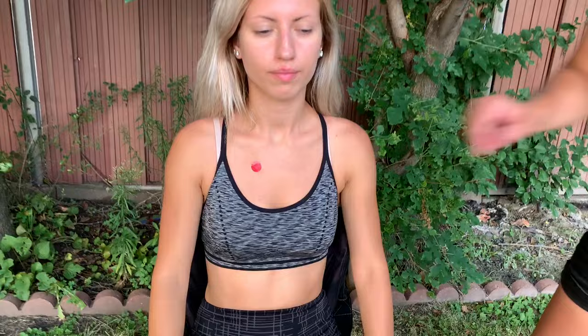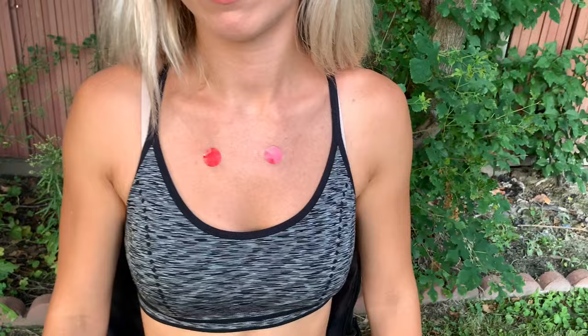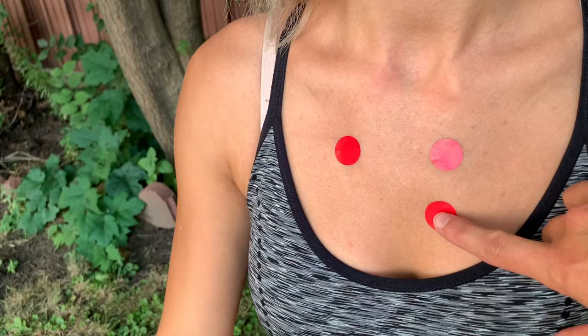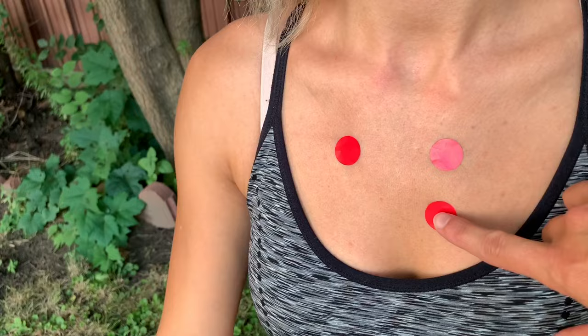The first point, second intercostal space, right sternal border, is the aortic valve. Directly across the sternum, the second intercostal space is the pulmonic valve. From the second intercostal space, we're going to go one down for Erb's point — that's third intercostal space, left sternal border.